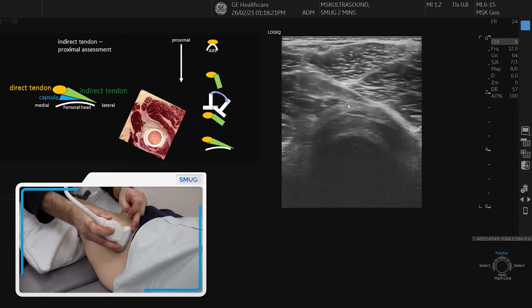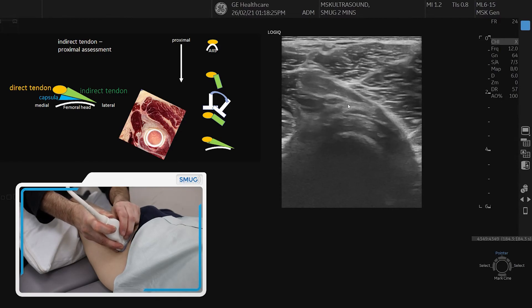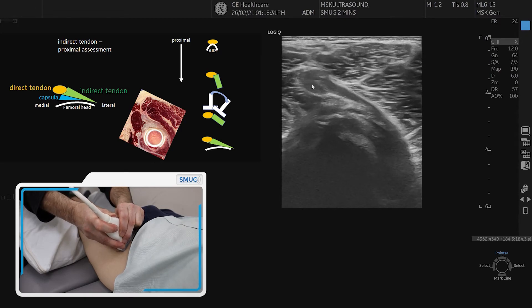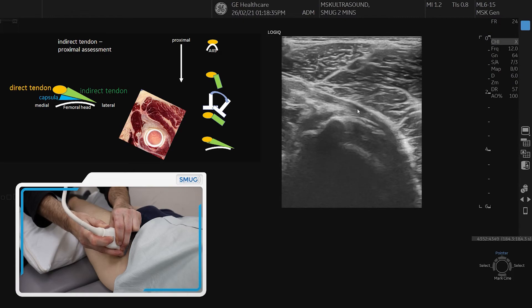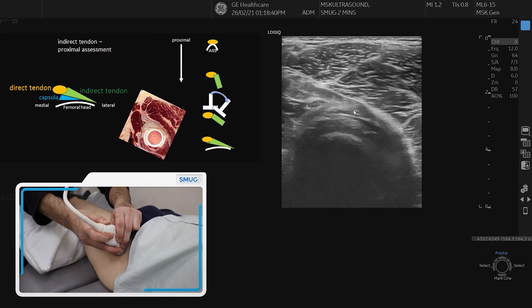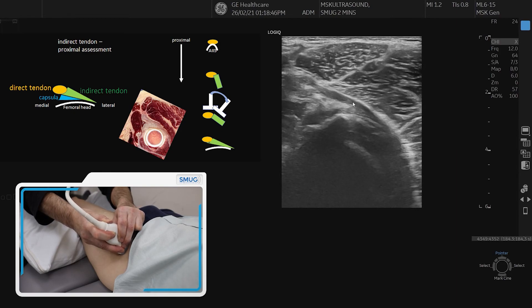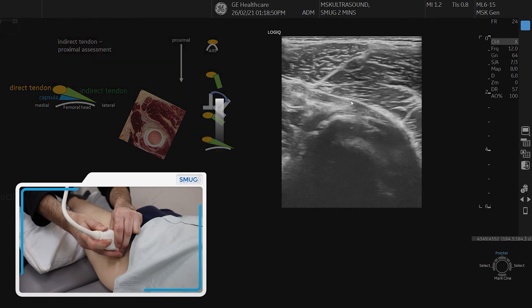The anterior part of the probe goes a bit down. What you now have is a view of the direct tendon on the left side in cross-section, and the indirect tendon coming off that going laterally. Between the bone and the indirect tendon is the capsule of the joint. If I focus on the joint itself, this is the articular cartilage with the capsule on top, and the indirect tendon sits there. That is the assessment of the indirect tendon in that plane.